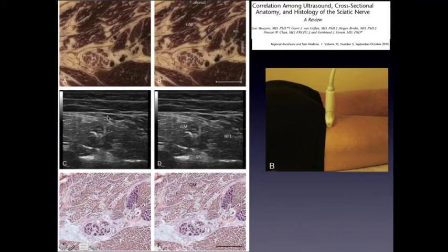In the ultrasound image there is this contrast, and here in the histology, we see again these are completely different tissues. This is the sciatic nerve, surrounded by muscles. And around it there's a very thin layer, which is not the epineurium, which contains some fat and small vessels.